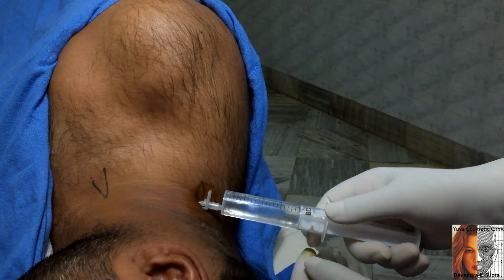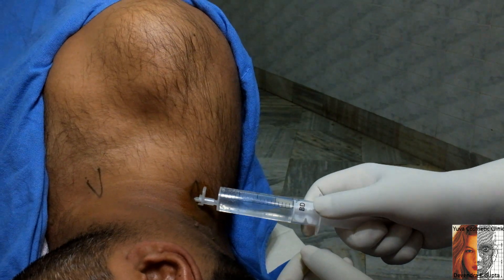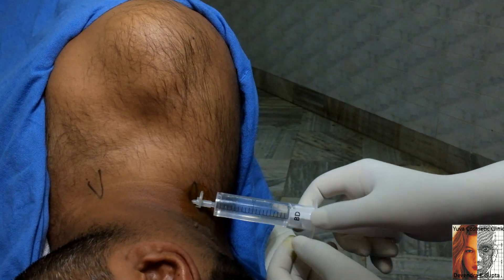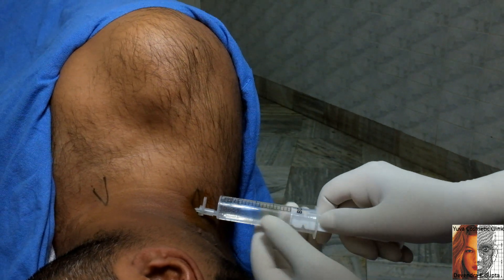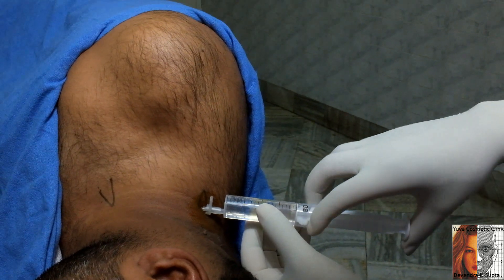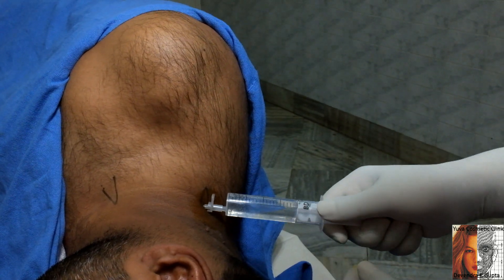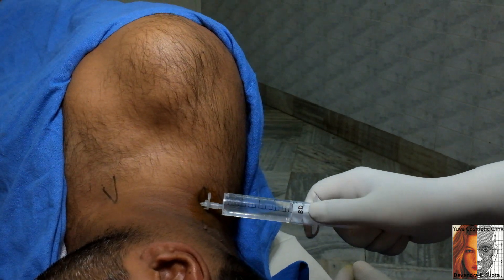I have taken 3 ml of xylocaine with adrenaline as a test dose, just to watch for any accidental intravascular injection — this would cause a sudden rise of the pulse. Be gentle and make sure there is no resistance. If there is resistance, manipulate the needle and go a little deeper.